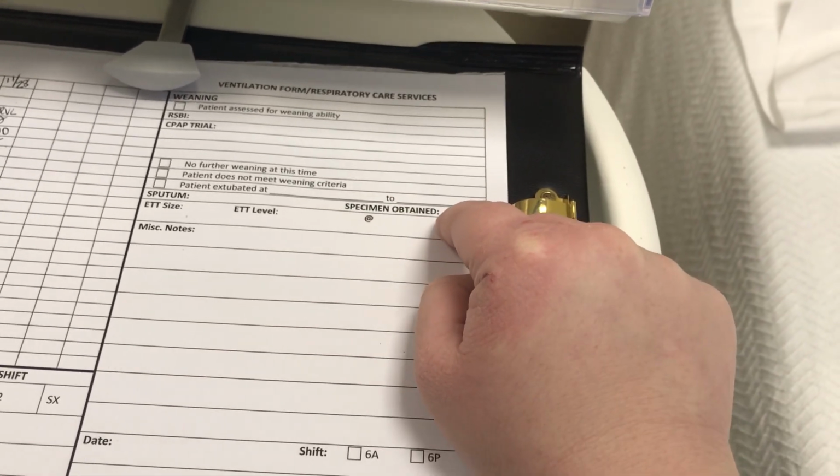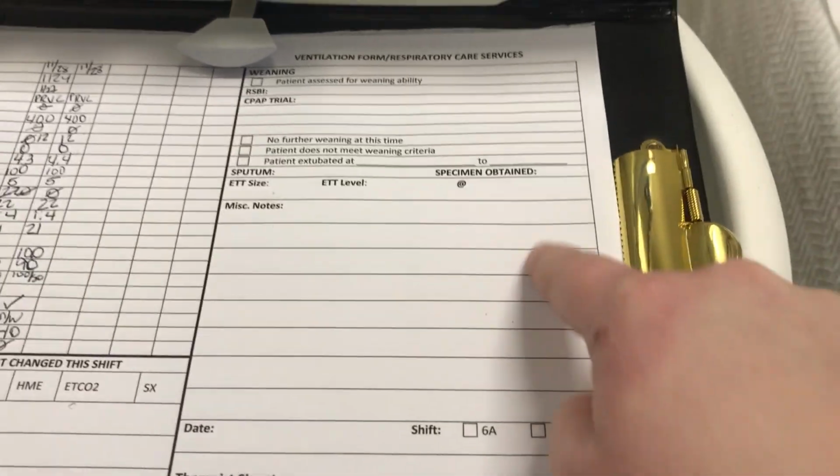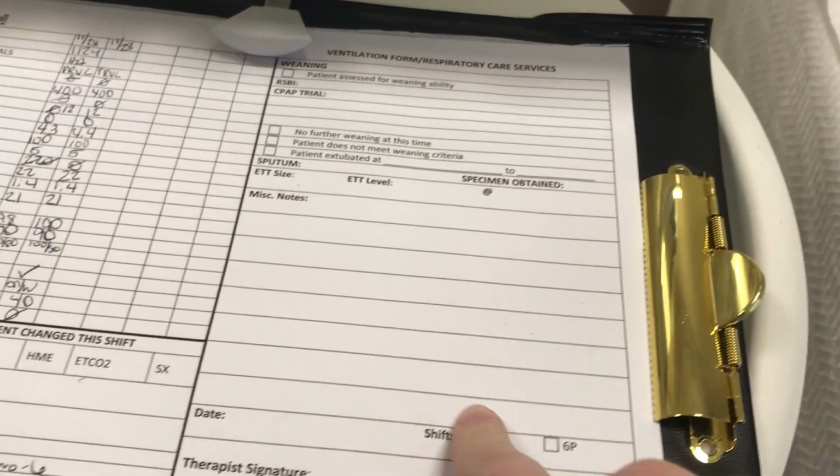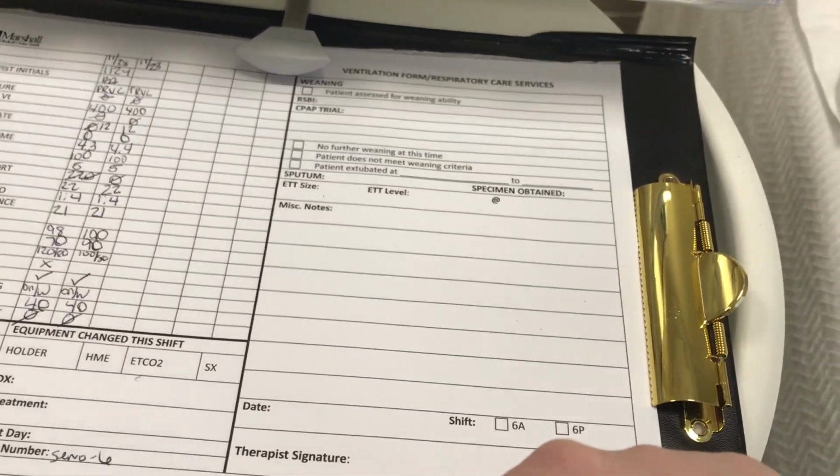Check the ET tube size and level. If you made any changes, you would write them here in initial, date, shift, and sign. That's it.